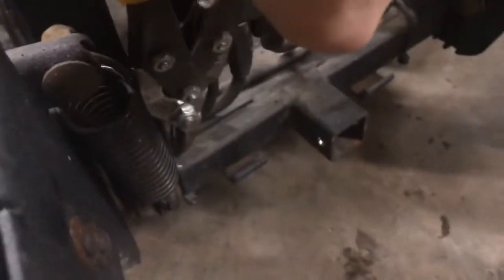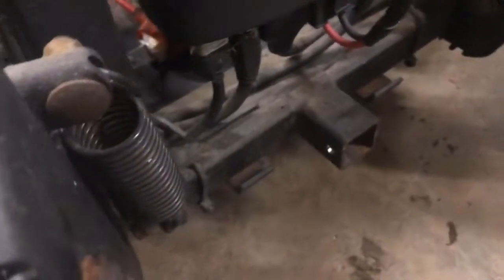Okay, you will have another zip tie here. So let's go ahead and cut it. Be very careful. Okay, so obviously, let's see. This one's actually hooked to the far end. Okay, so some light in here. So you see the plug here. There we go. And you see this little hump right here. So what you want to do, get my finger in the way, you want to press down in the middle. You should feel something go down. So you press down and move it to the left and right and pull down at the same time.